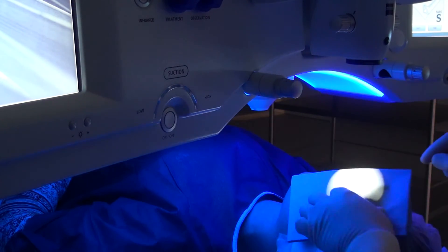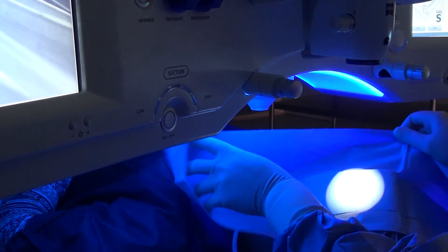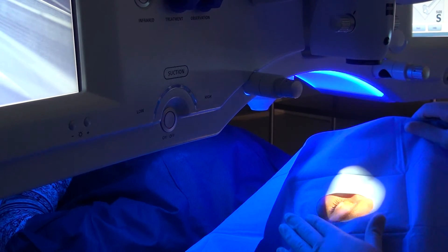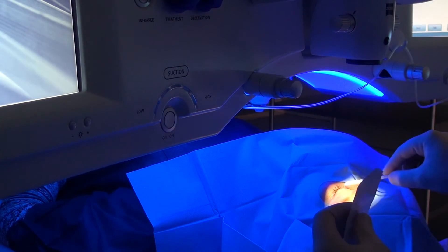Cover the surgical field with a sterile ophthalmic drape after disinfection. Make sure to keep all eyelashes out of the way, because exposed eyelashes could get under the contact glass, increasing the risk of suction loss.